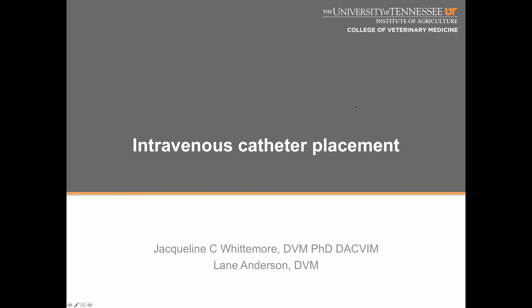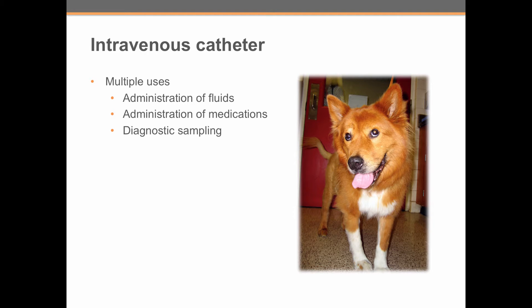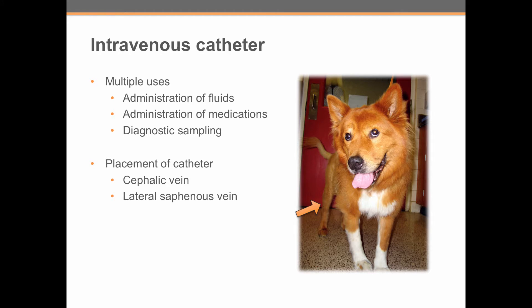Welcome to our tutorial on intravenous catheter placement. Peripheral catheters are used for multiple things, including administration of fluids and medications to sick animals, as well as diagnostic sampling when patients are in the hospital. Peripheral catheters are most commonly placed in either the cephalic vein or the lateral saphenous vein. During this lab, you're going to learn to place a catheter in the cephalic vein.